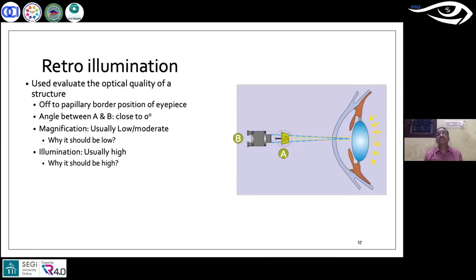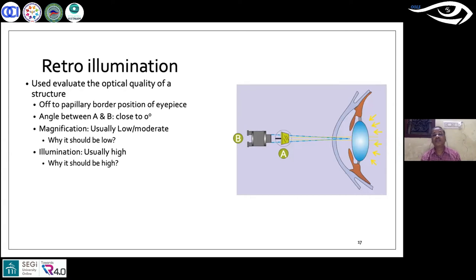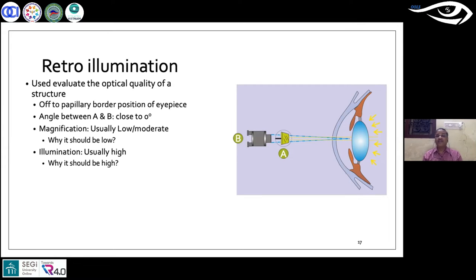Retro illumination is probably the most demanding technique compared to diffuse and optic section, as it requires some skill. Bring both the observation and the illumination system almost parallel to each other so they are in the same line. The illumination goes through the optical media, hits the retina, and reflects back. Keep magnification relatively low, but keep illumination relatively high so you get maximum light returning and can see the optical media clearly.